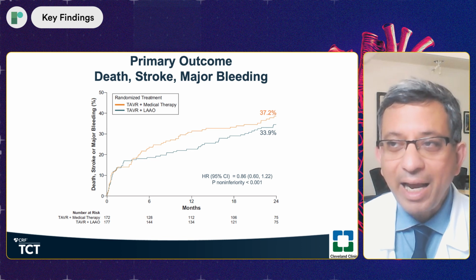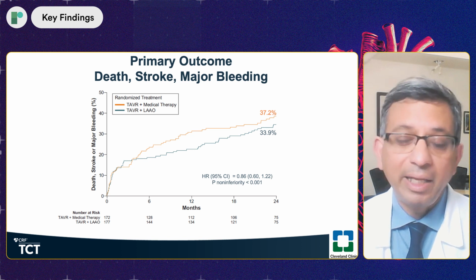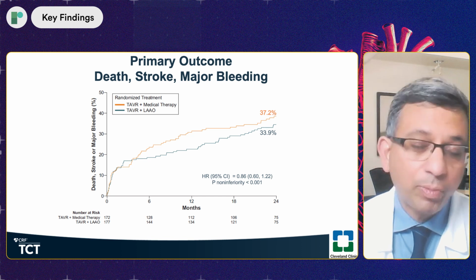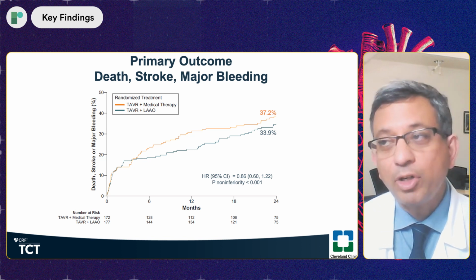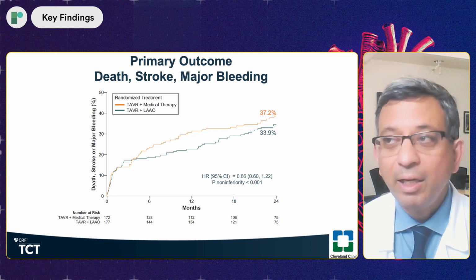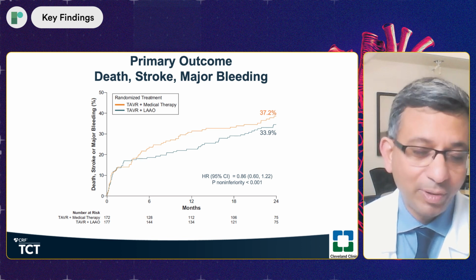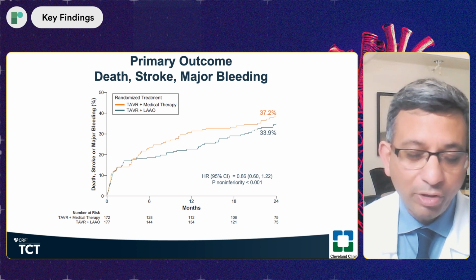The only risk it added was that 4 patients had some pericardial effusion, meaning that there was some blood around the heart, and they required just a needle aspiration of this pericardial fluid. And this is from the WATCHMAN device that was used. It's called WATCHMAN 2.5, the model number of the WATCHMAN. And now we have a newer WATCHMAN that does not cause this complication as frequently because it is safer to use, which is called WATCHMAN Flex. So right now the device that is available in the market is WATCHMAN Flex, because again, the trial took 2 years of follow-up. So the older device is so-called retired.